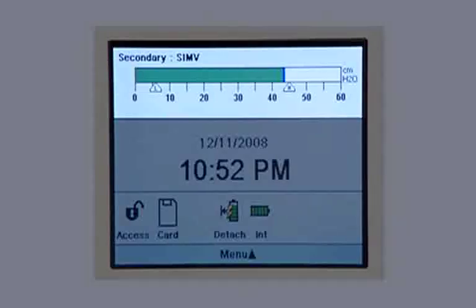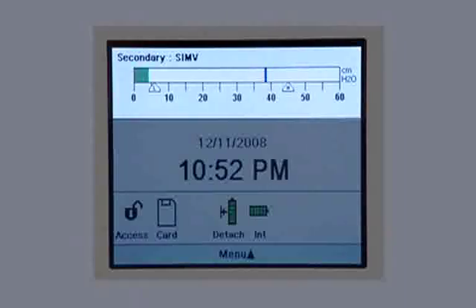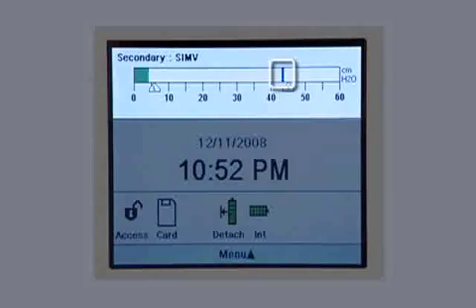A bar graph displays the current pressure level. Pressure is the amount of force it takes to deliver a breath to the lungs. The bar graph moves to the right as the pressure increases during inhalation and moves to the left as it decreases during exhalation. The blue bar on the graph indicates peak pressure — this is the highest pressure the patient has reached during each breath.